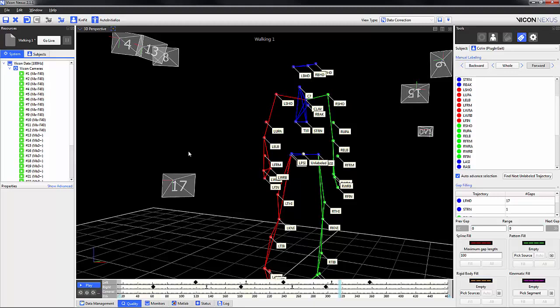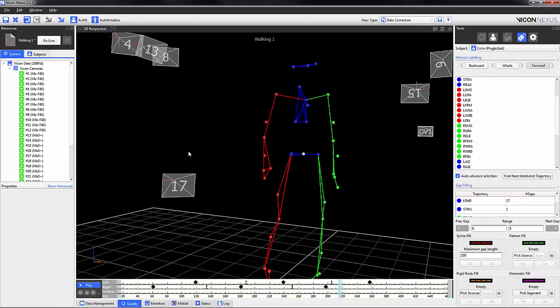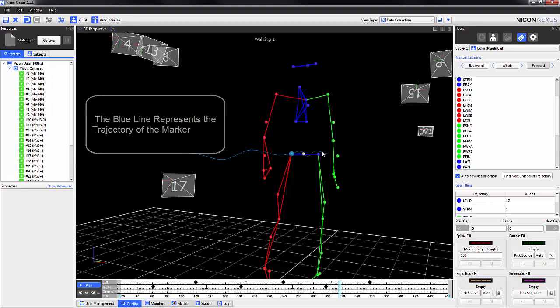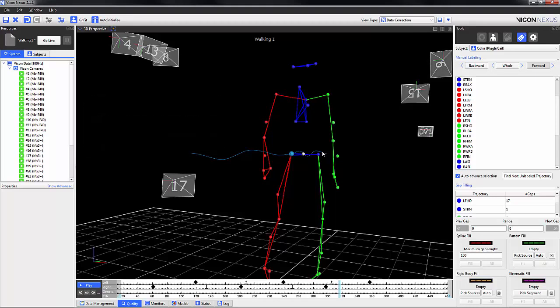To turn this off, press CTRL and space bar again. You can select markers by clicking on them. To select multiple markers at the same time, hold down the CTRL button and select as many markers as you want.